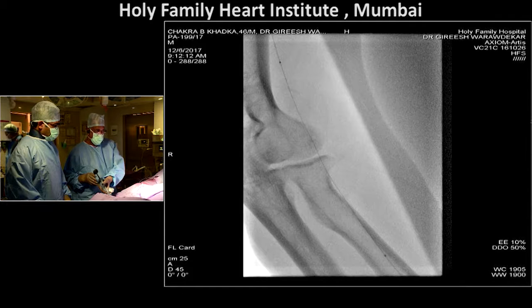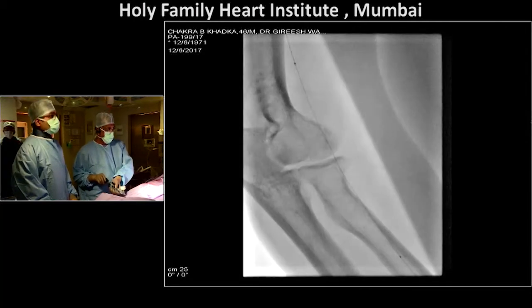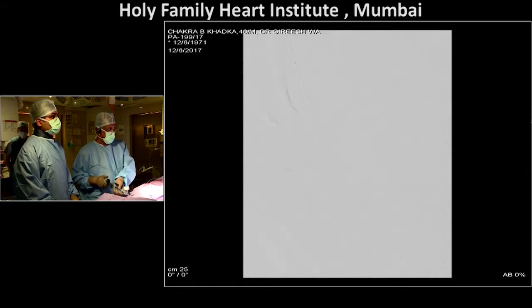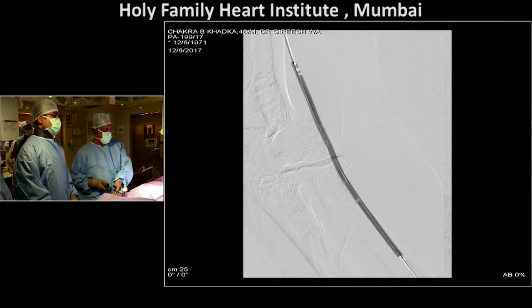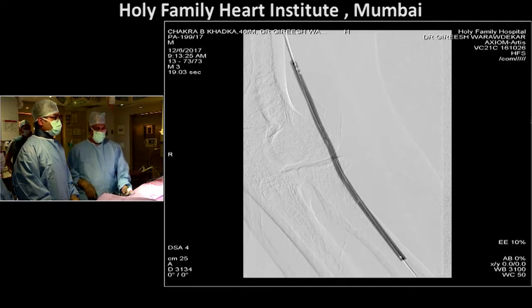You have the possibility to aspirate after the procedure. And another option, although it seems chronic, is not a bad idea: go retrograde with just a catheter and try to aspirate as much as possible of this lesion, because there is probably some thrombus. So you mean do thrombus aspiration? Why not just pass with the catheter? It will gather some of the thrombus material and relieve it if there is a thrombus burden in this lesion.